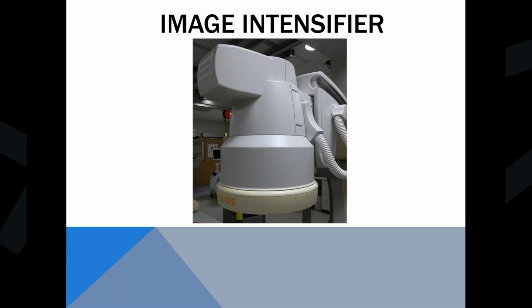So down here, this flat surface underneath is made out of cesium iodide. What cesium iodide does is it takes the X-rays and converts them to light, and that makes it easier for the camera to record light over X-ray. Then the image is run up through the intensifier, and then comes out the output. And right in here is the CCD camera.